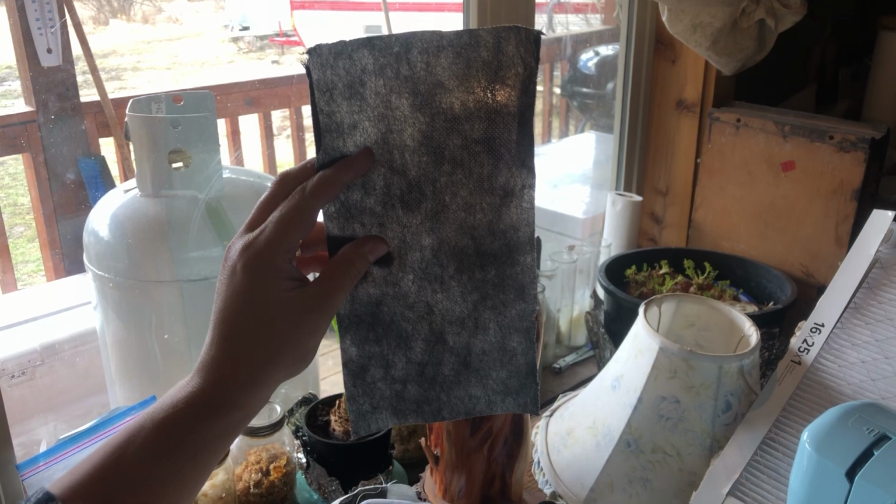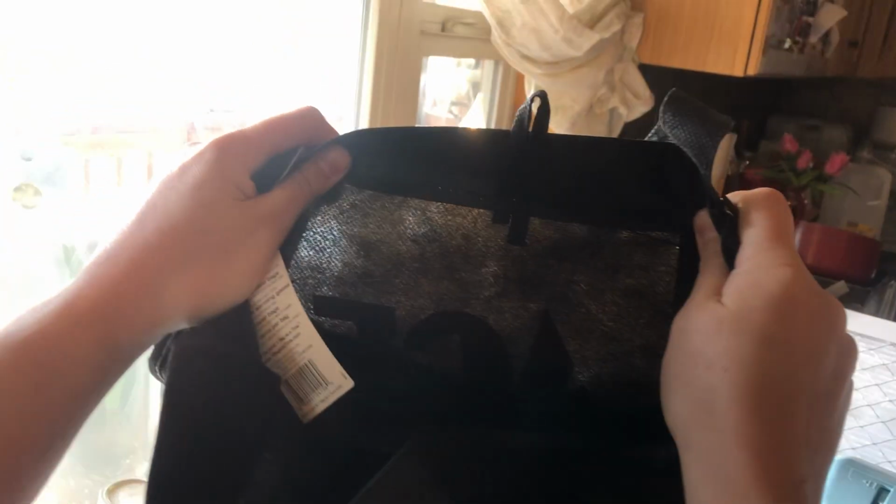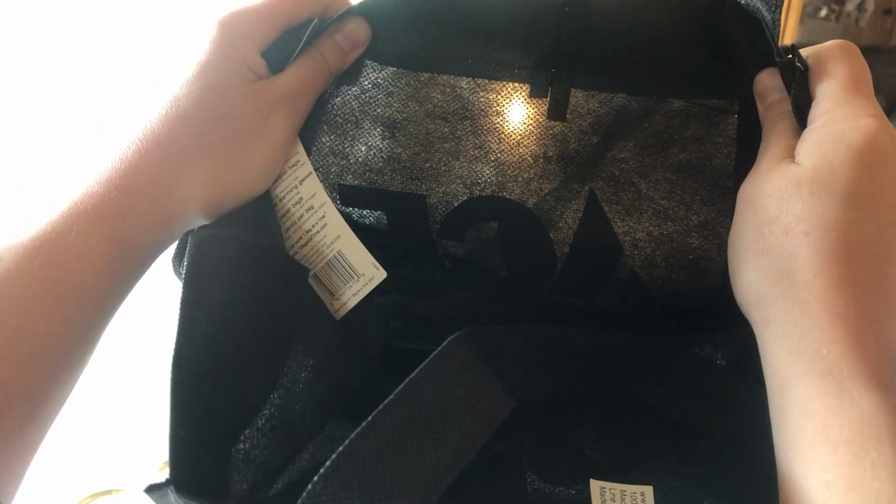This has not been tested. It's like an interfacing, or what I'm using is used cloth grocery bags. Will you hand me one of those, Dad? Ace Hardware also donated these to me. These are the grocery bags, and as you can see, yeah, you can see through it. Okay, you can see the pressed fabric in there. So that's what I'm using.